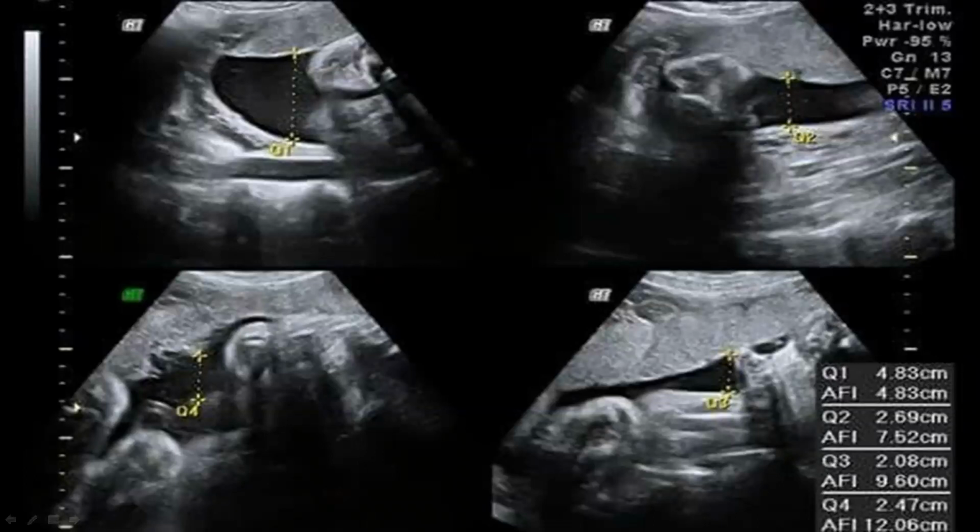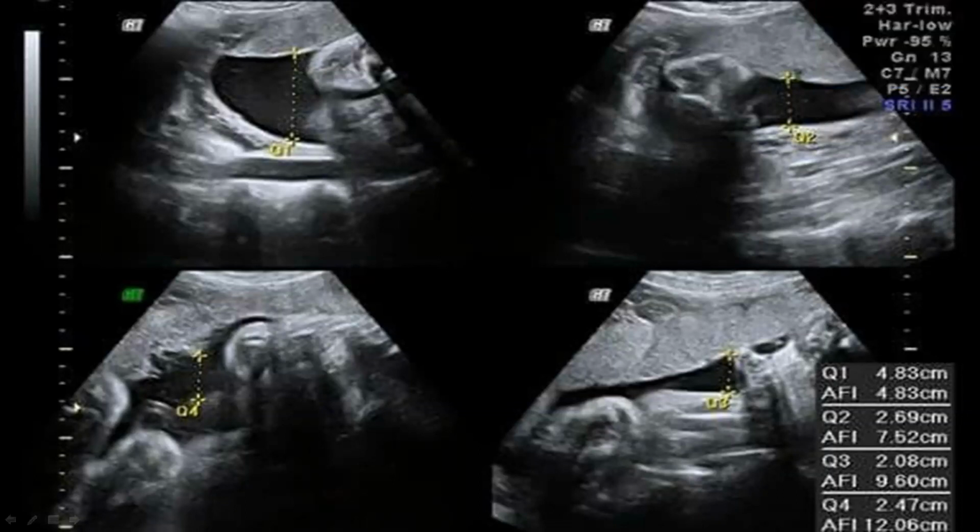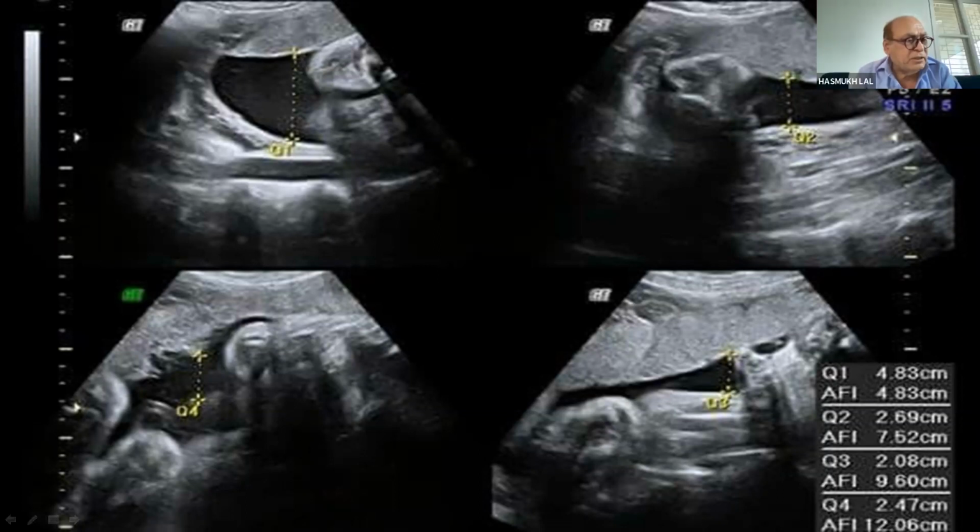Next question. Number 6, for location and position of the placenta, there is a single choice. The transducer is held sagittally and moved from fundus to symphysis pubis on lines 1, 2, 3. That is the correct answer. B is the correct answer.